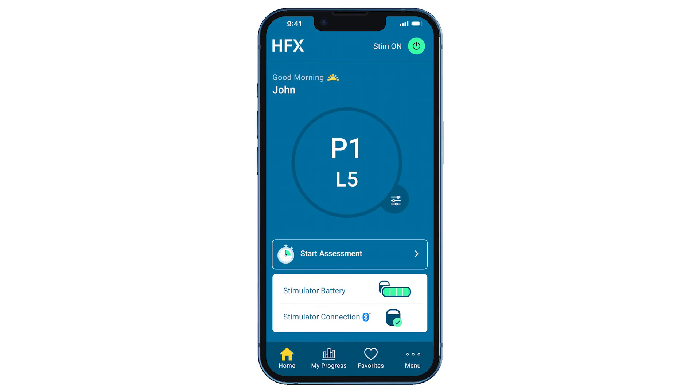When using manual mode, you will adjust your program settings based on the guidance and schedule provided by your Nevro HFX care team. You will know you're in manual mode when you see HFX in the upper left-hand corner of your screen.